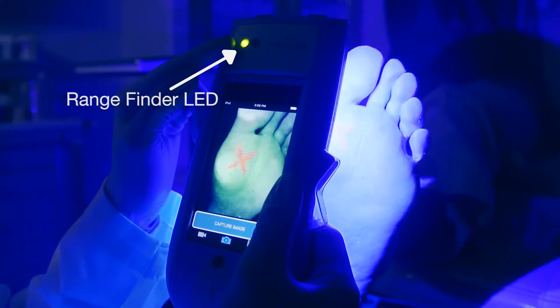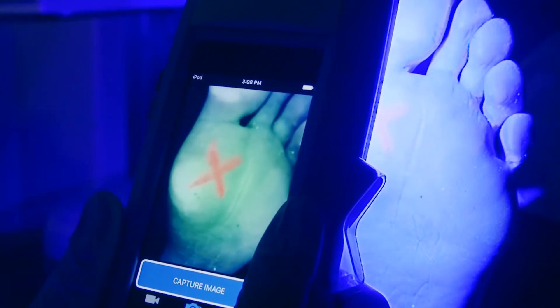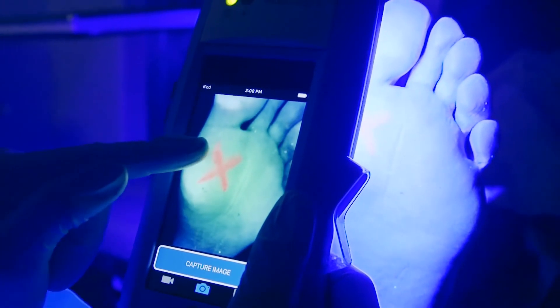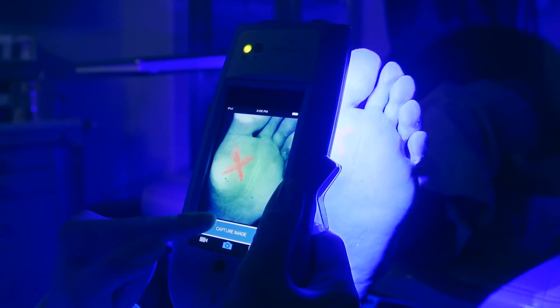Watch the rangefinder LED as you move the device to and from the wound. When the LED is green, you're all set. You can improve the autofocus by manually tapping the screen on the exact area you want in focus, and a focus square will appear. Then press the capture image button to take a still photograph.